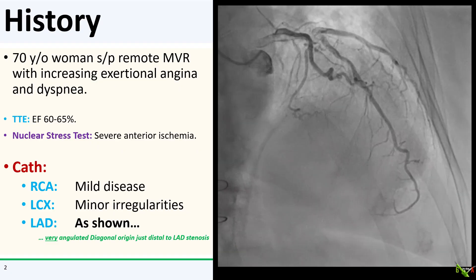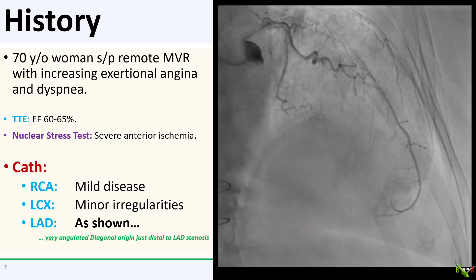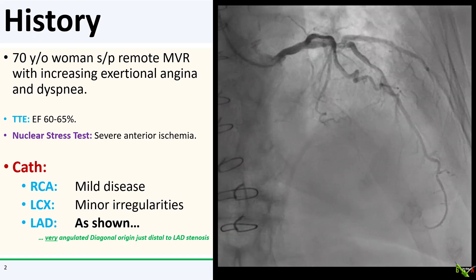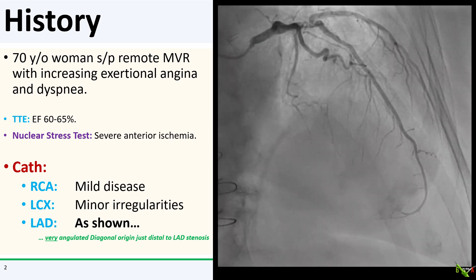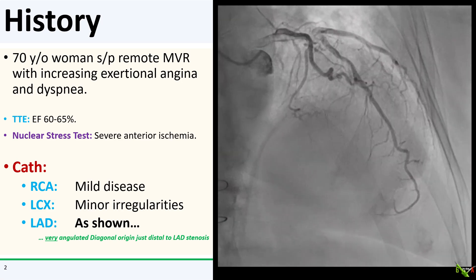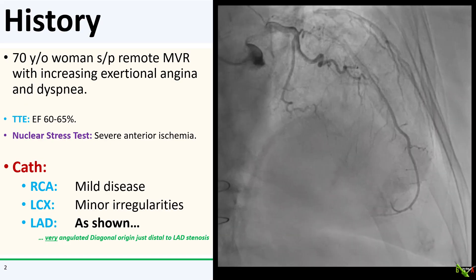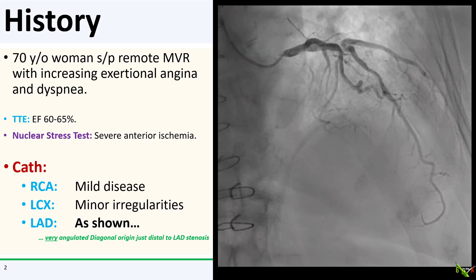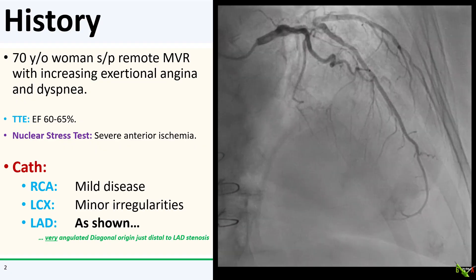The patient is a 70-year-old woman with a remote mitral valve repair. She's been experiencing increasing exertional angina and had a markedly positive nuclear stress test with severe anterior ischemia. Her cath showed minor disease in the RCA and circumflex, and here is her LAD. As you can see, there is a severe stenosis in the proximal LAD that is likely the culprit.